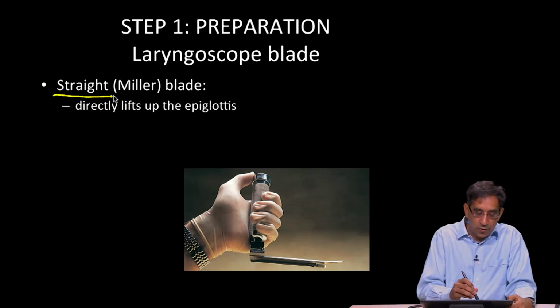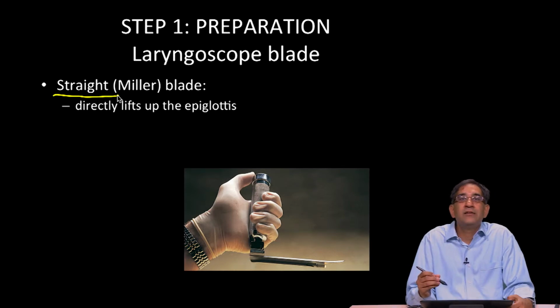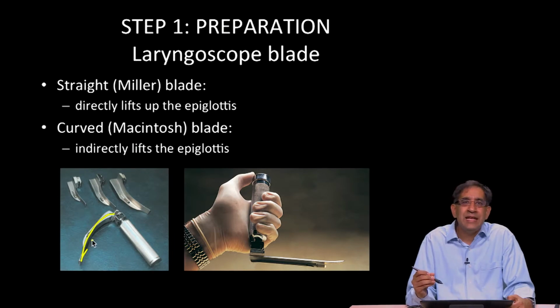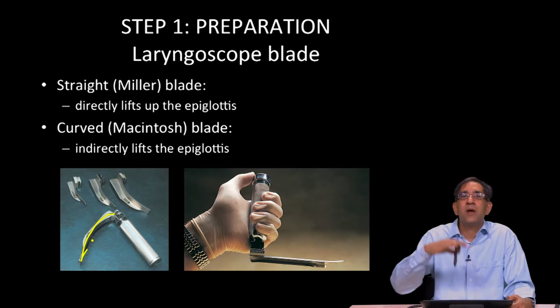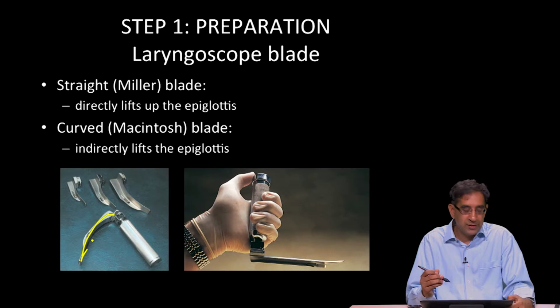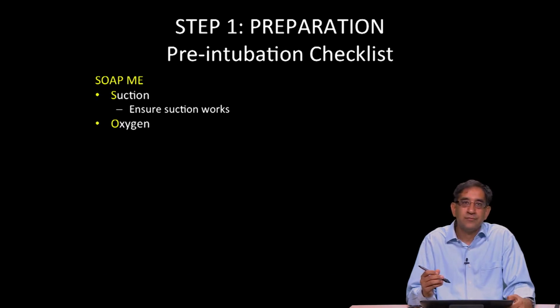The straight or Miller blade, as we'll find out, directly lifts up the epiglottis to give you a view of the vocal cords. The curved or Macintosh blade, as seen here, indirectly lifts the epiglottis by being inserted into the vallecula, and then you lift up and the epiglottis comes along with it so that you can see the vocal cords. There are different sizes for the Miller and Macintosh blade depending on the age and size of the patient. So you want to get the appropriate sized blade depending on the age of your patient.